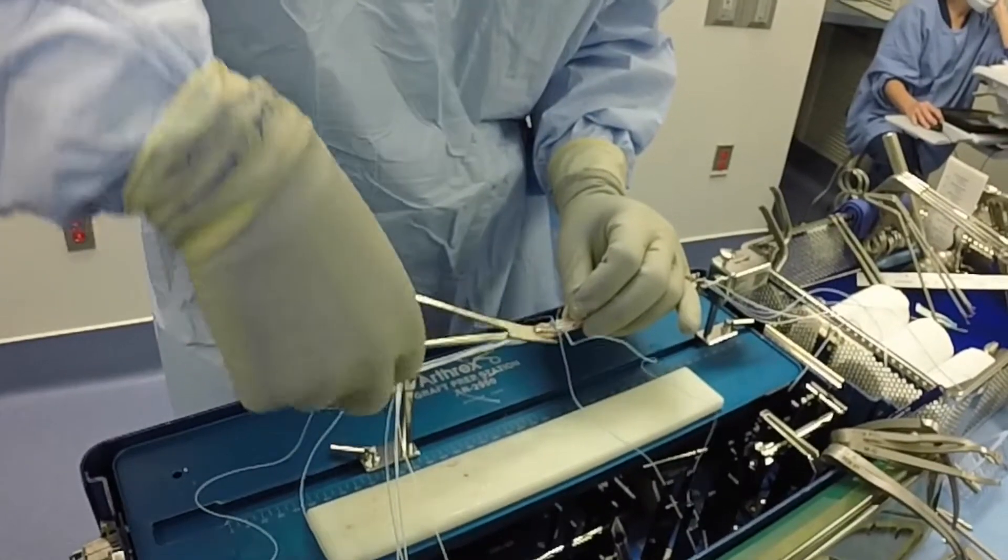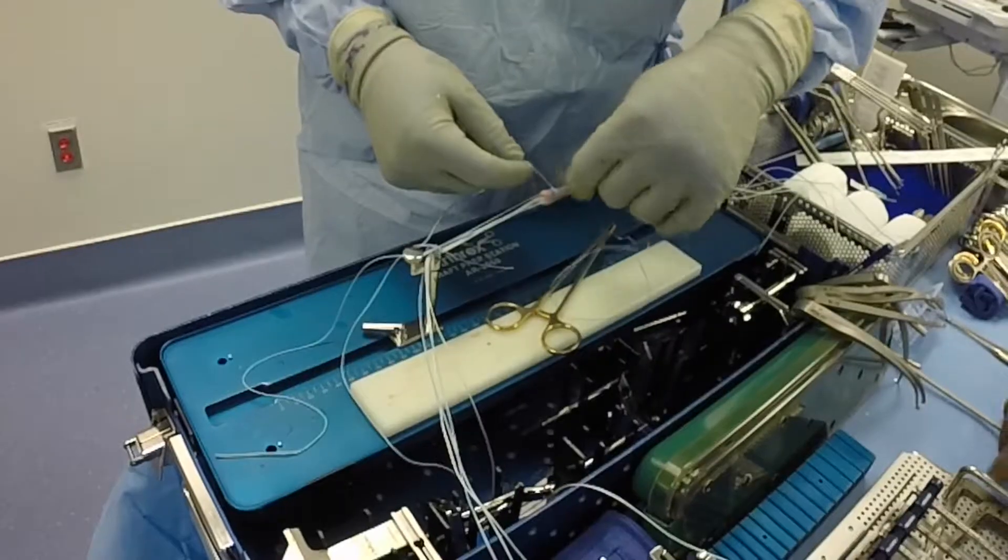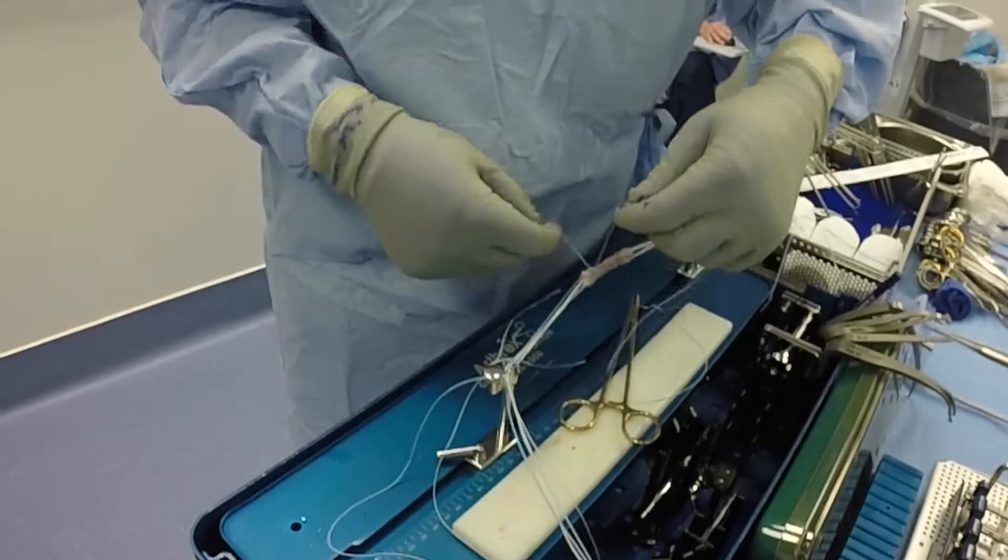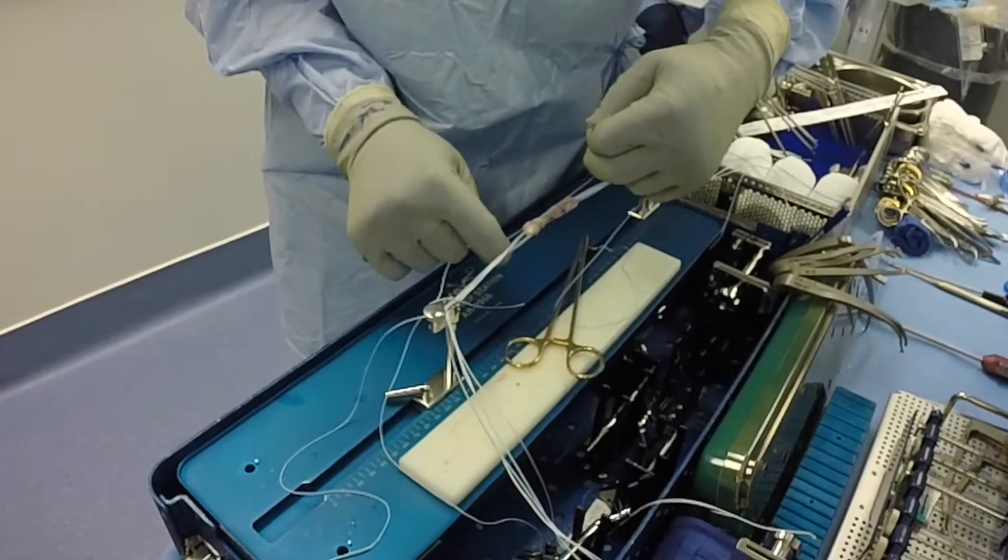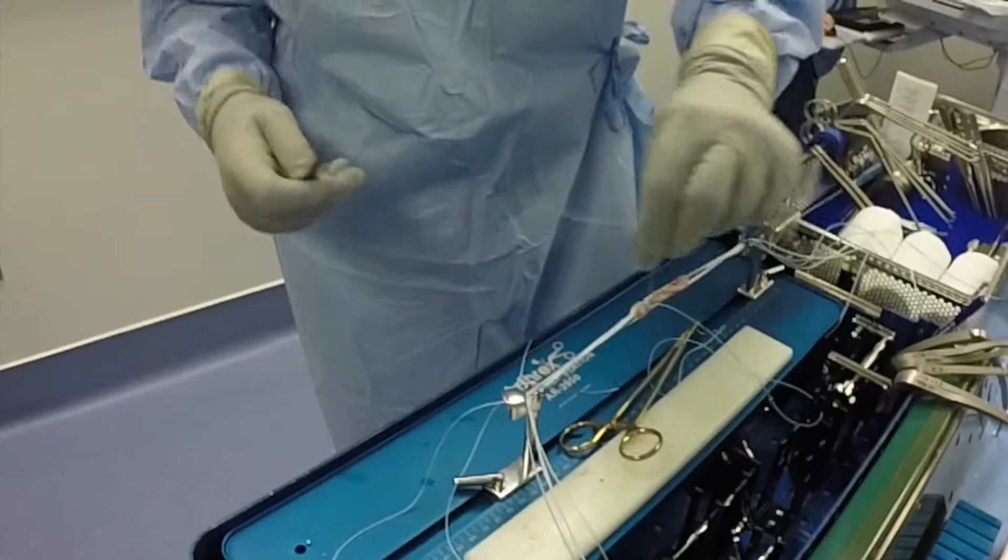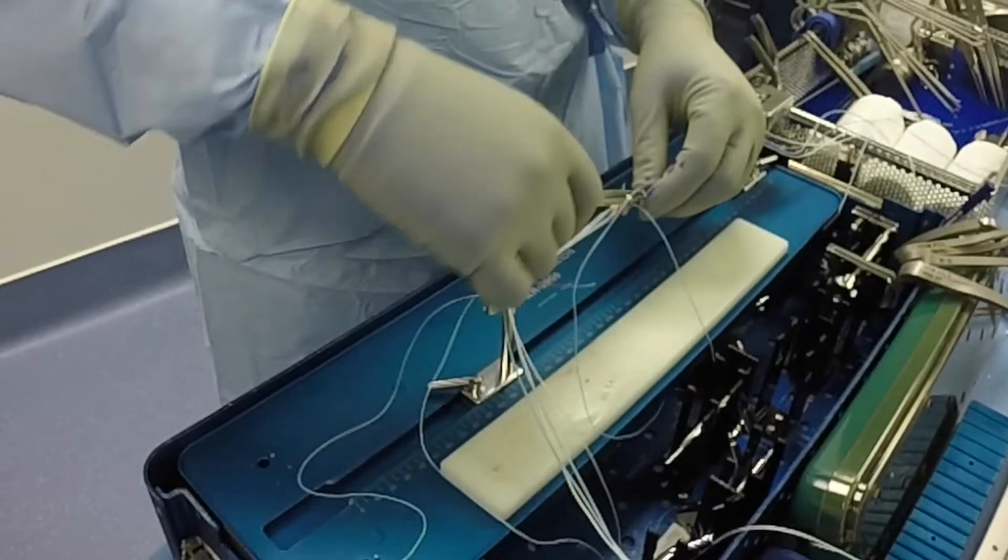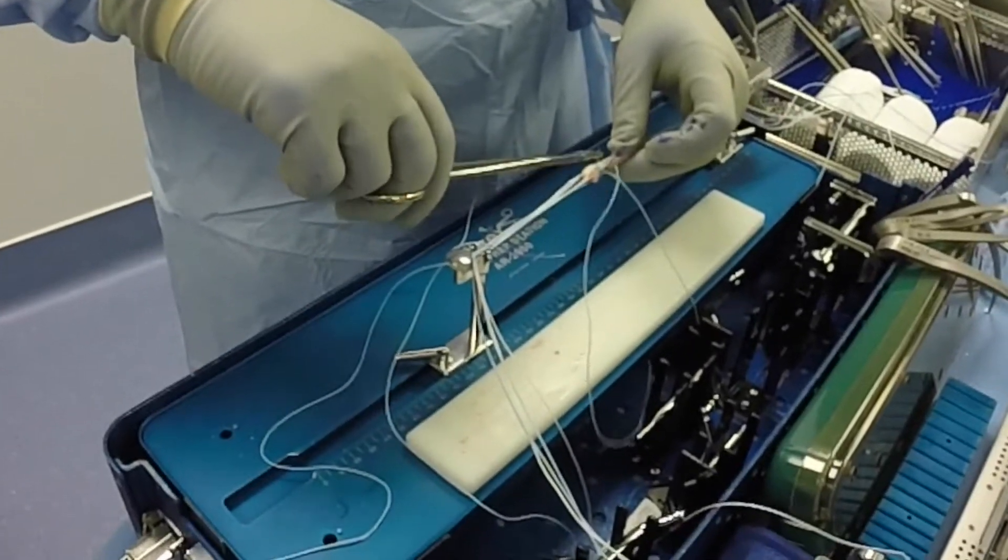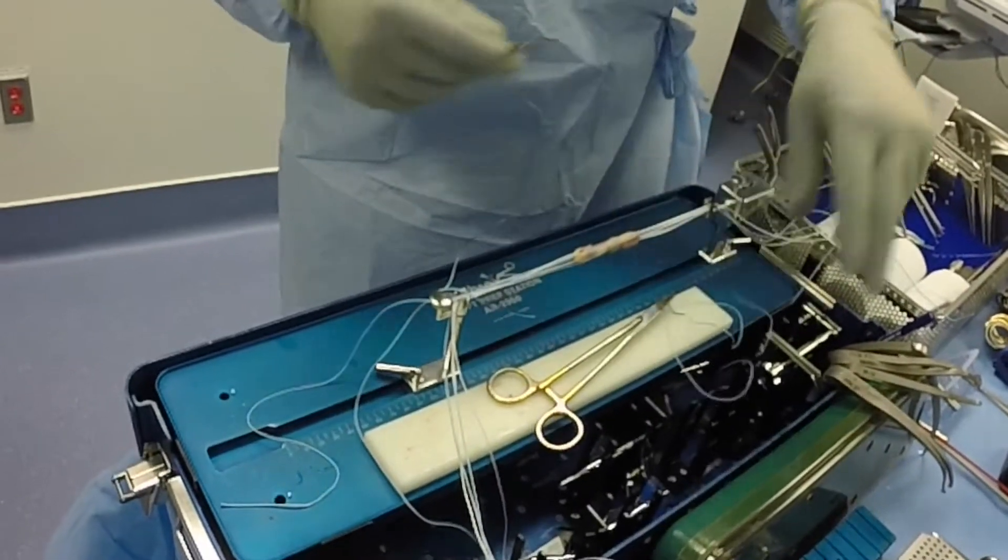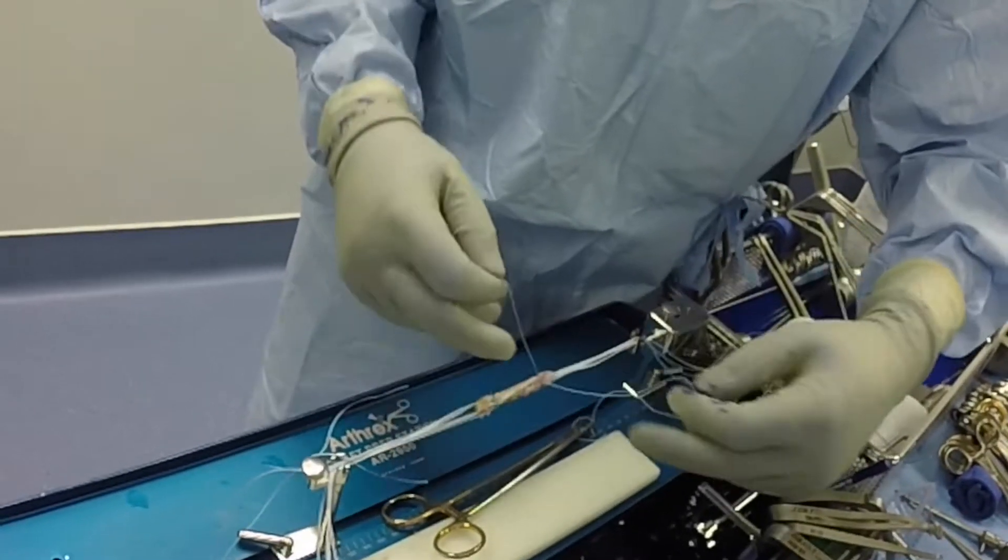And you can see the suture is tied within the central portion of the graft. One end of the suture cut, and then burying the other tail to pull the knot within the central portion of the graft. This is then repeated at the other end.